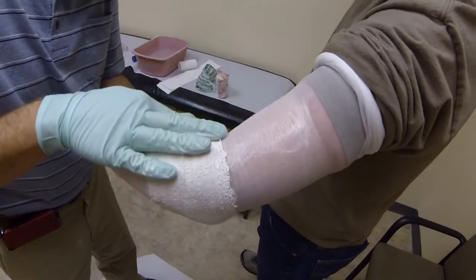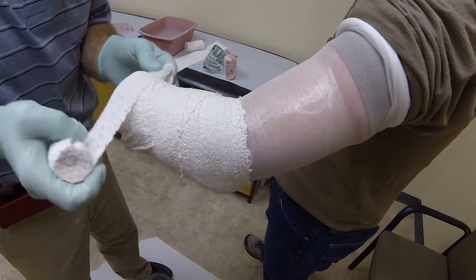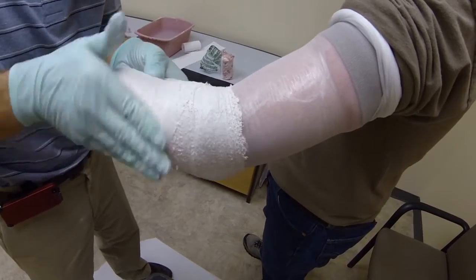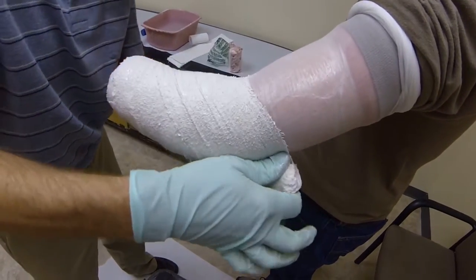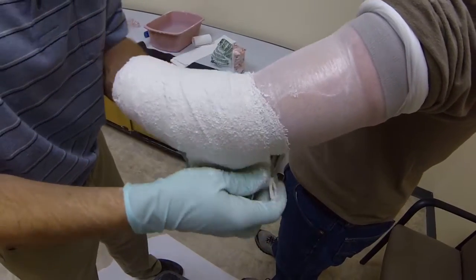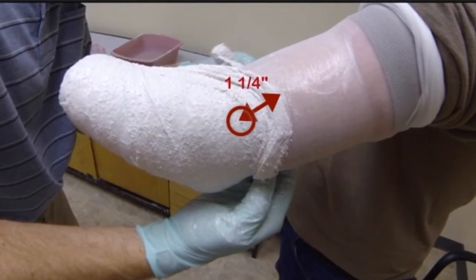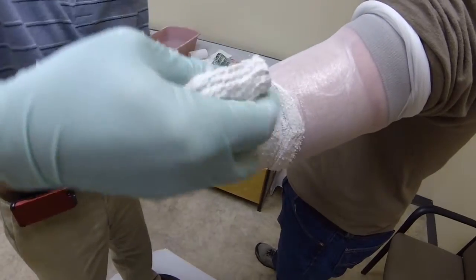Let's take a look at the cast. The proximal edge of the plaster wrap should be about 1¼ inch proximal to the epicondyles, both medially and laterally. The posterior wall should be approximately 1½ inch proximal to the olecranon, and the anterior wall should be just to the cubital fold.